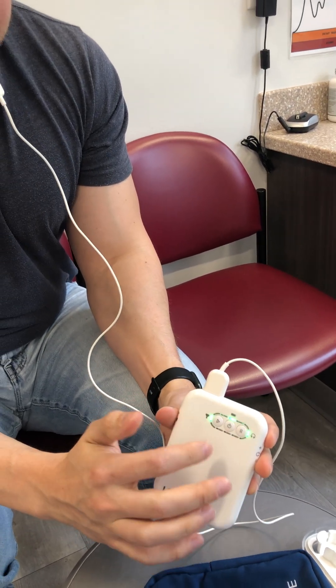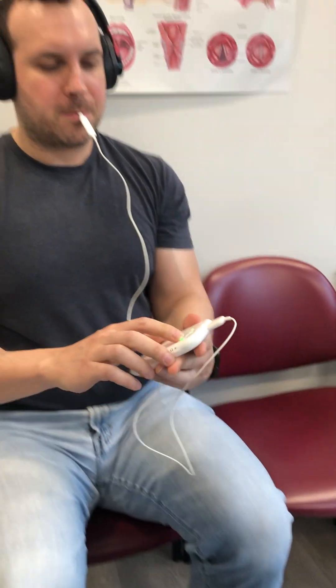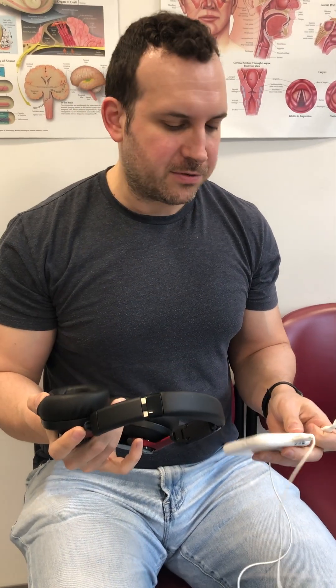Okay, and that's what you're seeing here — and you're hearing something now? Correct, so it's like a small melody and some static in the background, and it runs for about 30 minutes or so. Okay, and 30 minutes — how often? Thirty minutes twice a day.